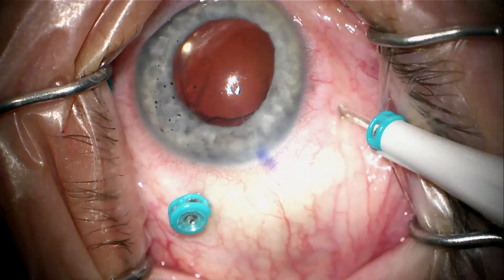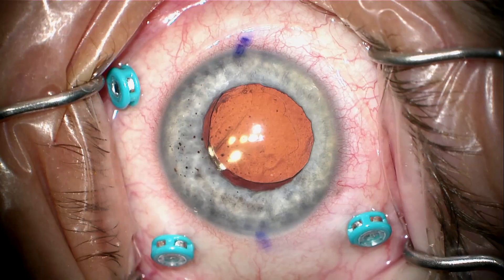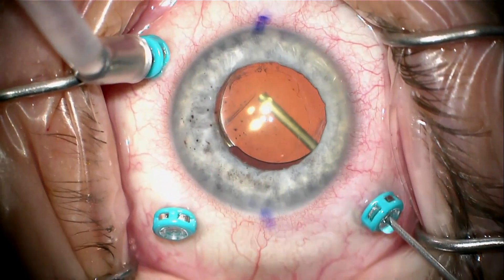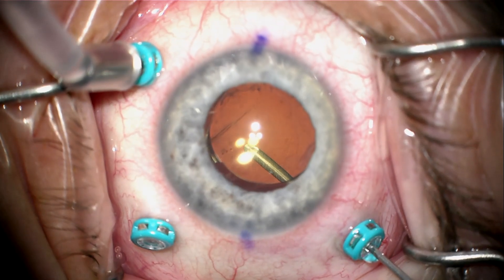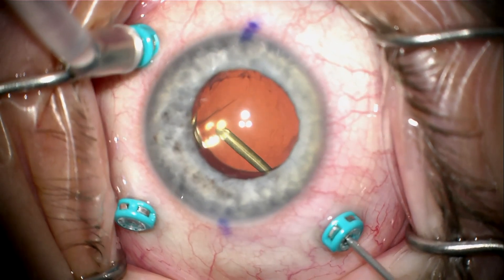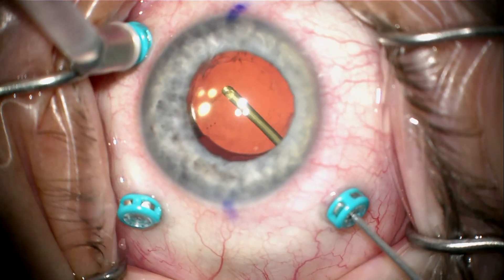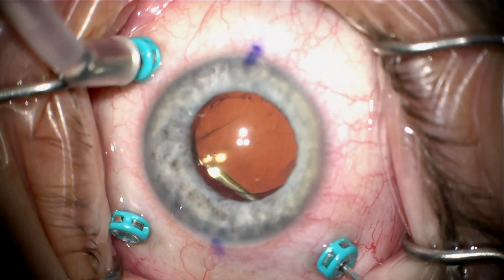The implant itself appears stable. The haptics are covered by the anterior capsule, even though there is a radial tear in the posterior capsule. We don't think we need to do anything with that, except to treat the residual astigmatism with a limbal relaxing incision (LRI).